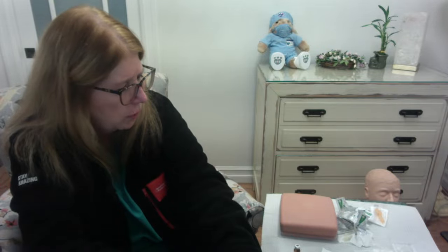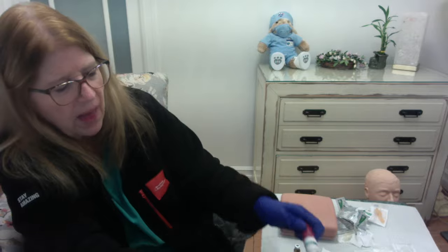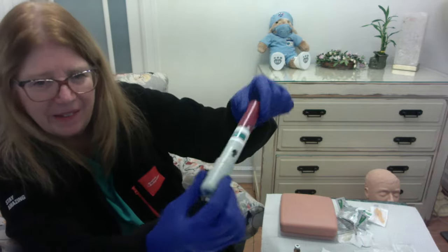All right, so I think that is pretty much a brief overview of intradermal, subcutaneous, and IM. You certainly will have some practice in lab. The last thing that I do want to talk about just for a moment is that of these pens, right?